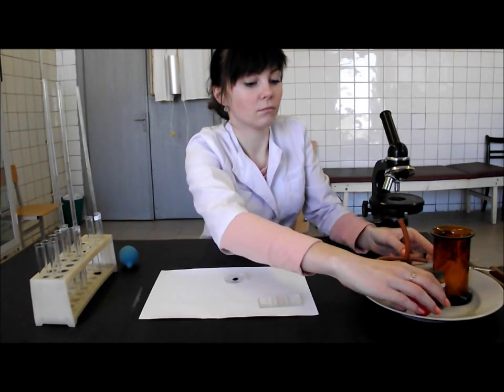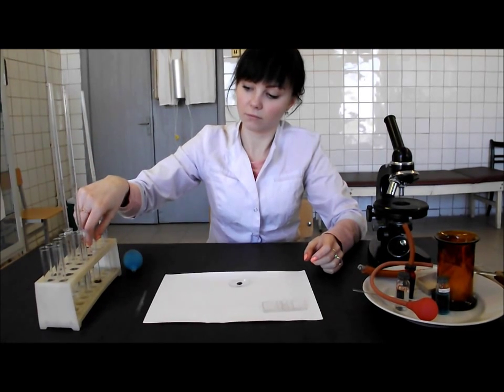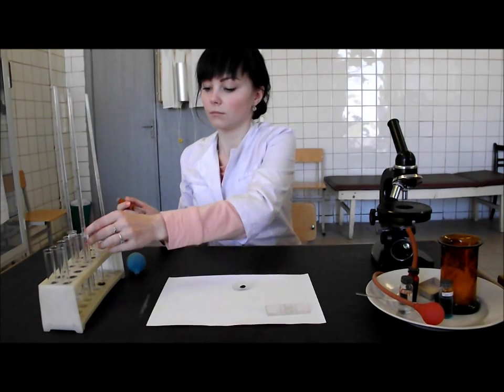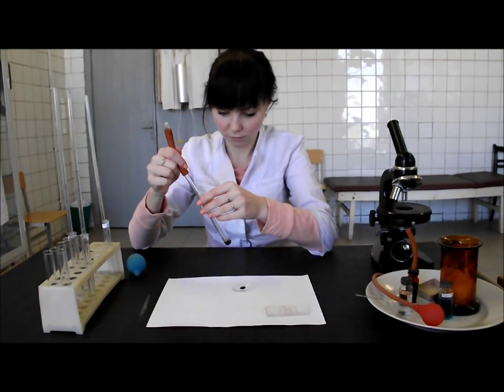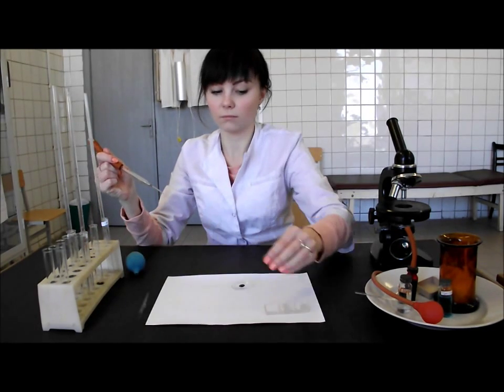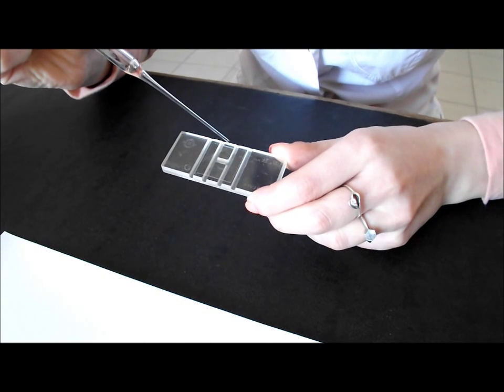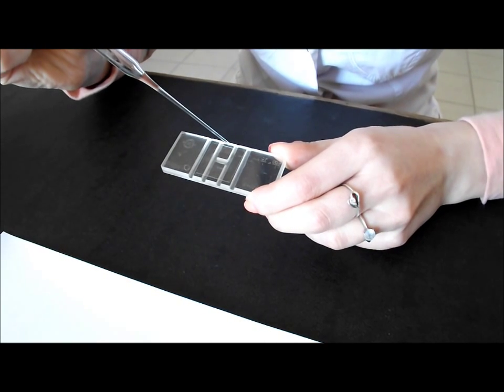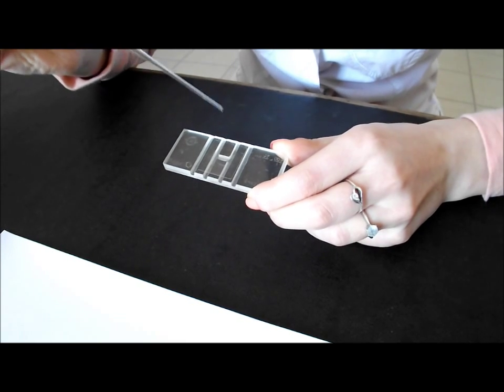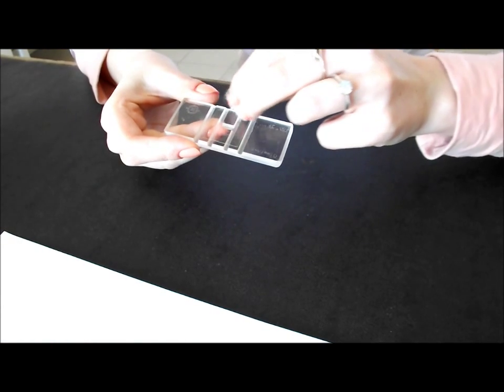Then, slowly waving the test tube, mix its contents. Take the obtained solution into the Pasteur pipette. Bring the tip of the Pasteur pipette to the junction of the covering glass and the chamber. Put a small drop of the solution on the middle stripe of the Goryaev chamber — it will run under the covering glass under the influence of capillary force. The excessive solution is removed with the help of cotton wool.